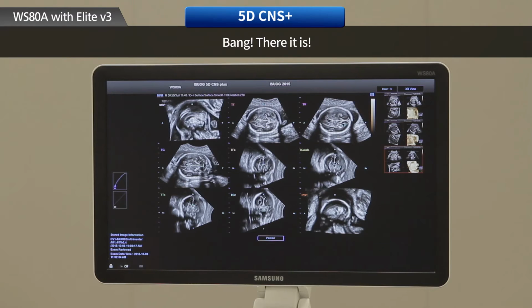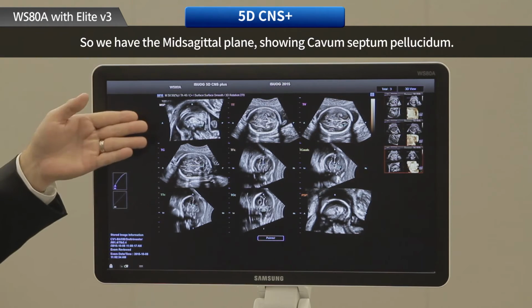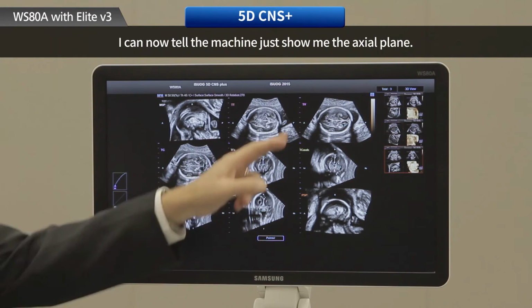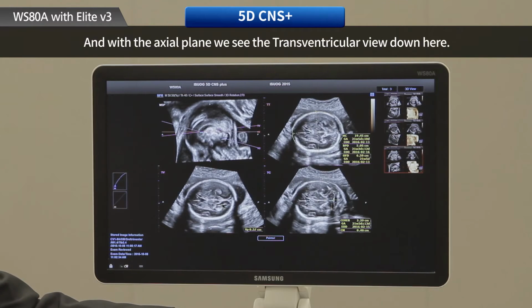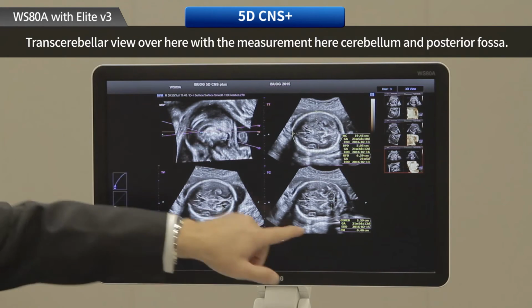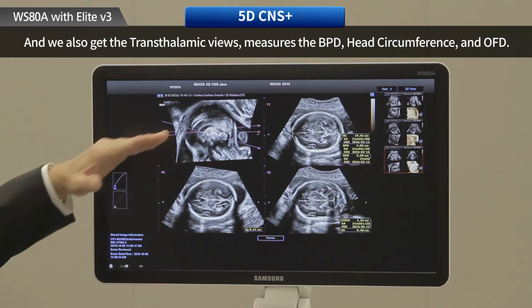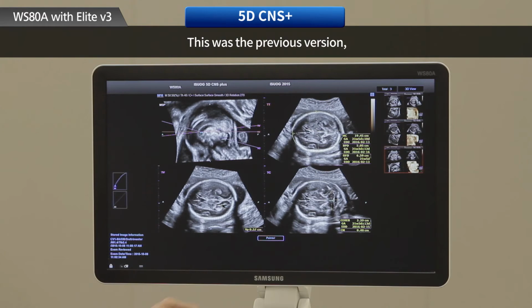Bang, there it is. So we have the mid-sagittal plane, showing the cavum septum pellucidum. We have our true BPD level, cavum septum all the way through. I can now tell the machine, just show me the axial planes. And with the axial planes, we see the transventricular view down here, transcerebellar view over here with the measurements of cerebellum and the posterior fossa. And we also get the transthalamic view that automatically measures the BPD, head circumference, and OFD. This was the previous version.